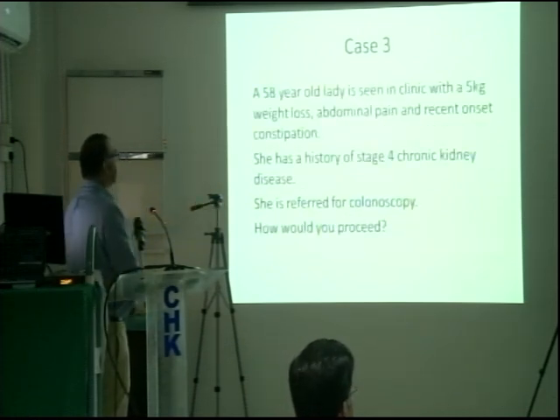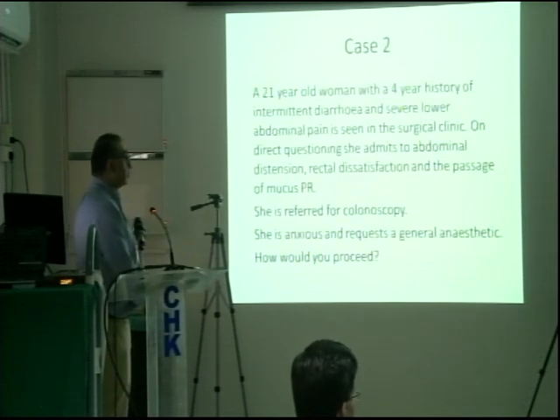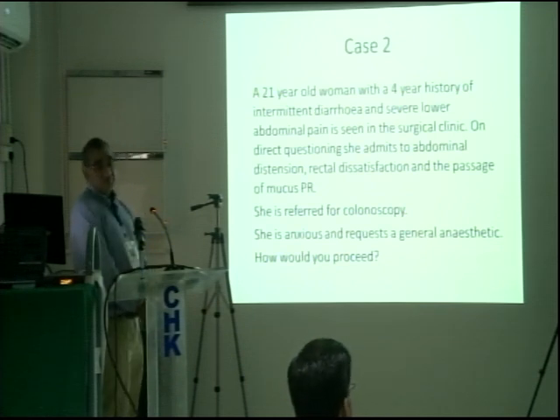And one point while you're on it, I'm sure you must have touched on it in the course. Is colonoscopy done under general anesthesia or under sedation? Is propofol more dangerous than without?